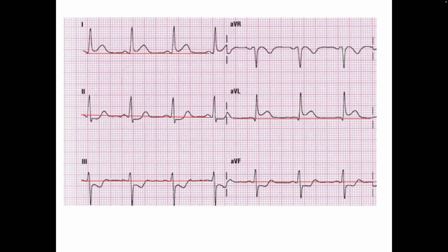Yeah, so here's what I'm showing you, it's barely a millimeter. If it's borderline elevation and borderline STEMI? It's hard to answer without, I don't consider this one borderline, by the way. But generally speaking, it sort of depends. It depends on if the pattern is there.